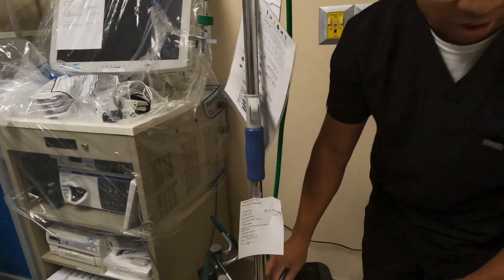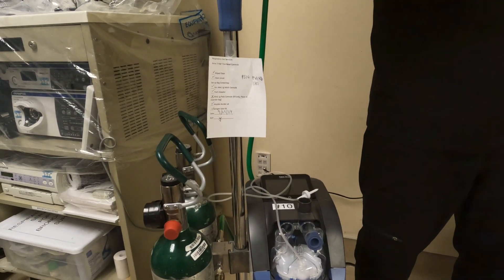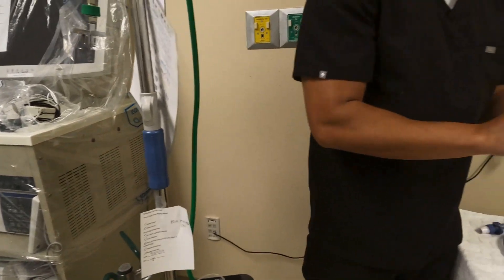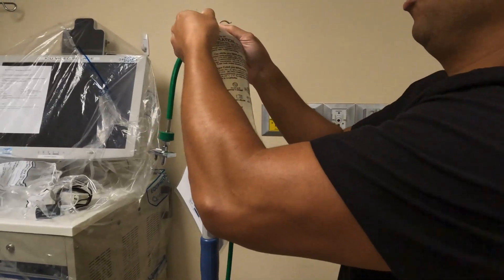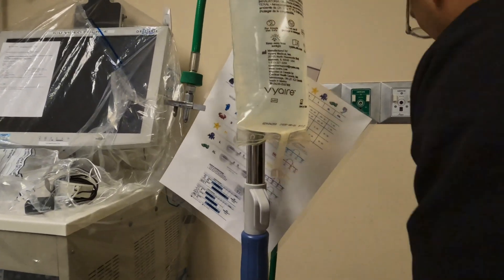We're going to go ahead and attach our sterile water for inhalation. We're also going to puncture it and open the vent cap.